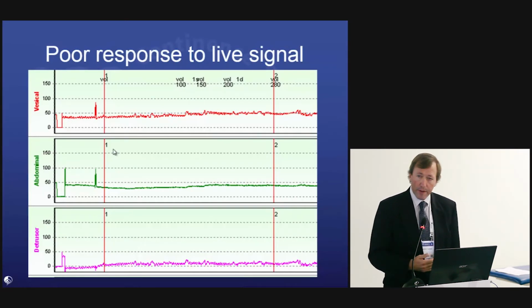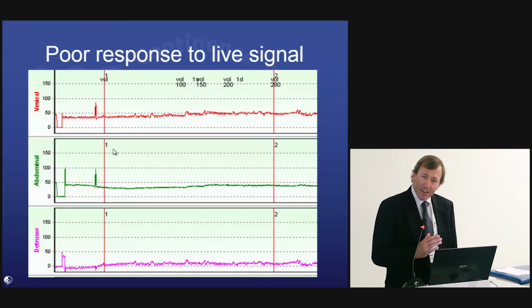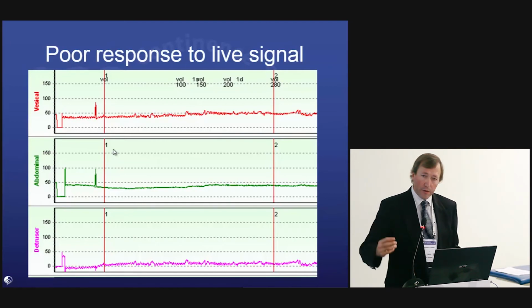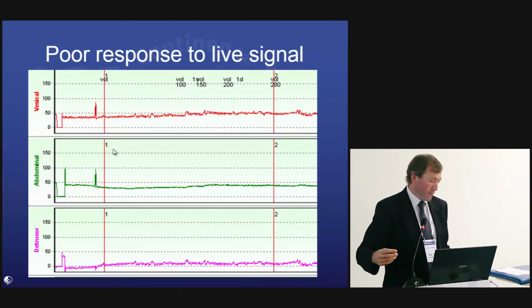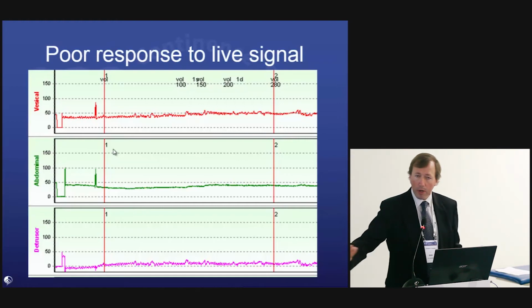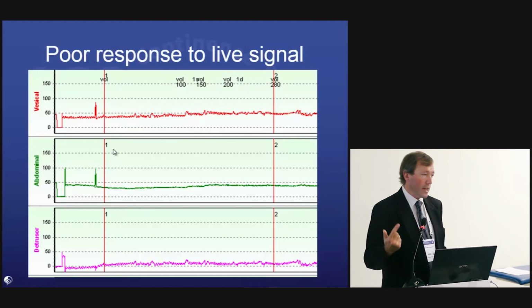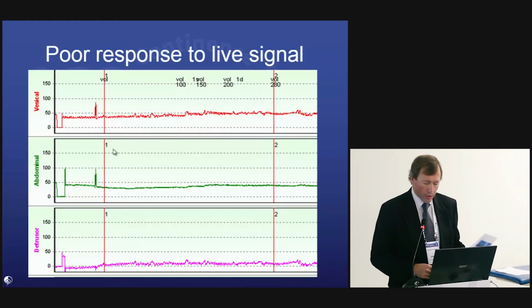Even though the cough is good there, you might want to check, if this is a laughing or a moving patient, a breathing patient, you hope, that you've got good response, better response on the abdominal line. If you've checked it's not a pump artifact, if you've checked that there's no noise or nothing touching the line, then I would flush through and check with a cough that you've got a live response and a cough response on both lines.